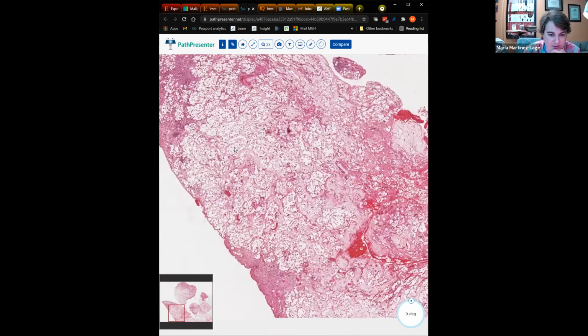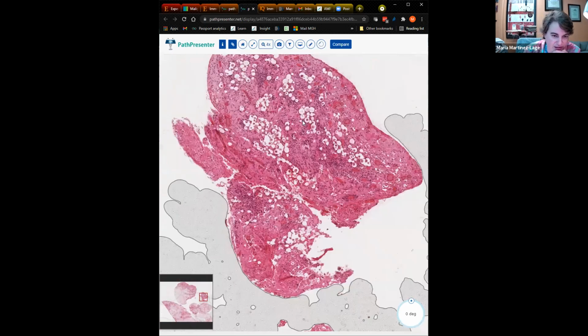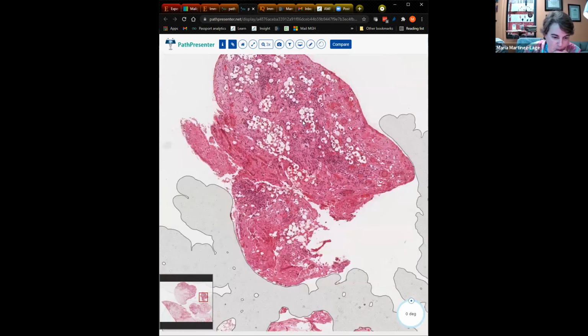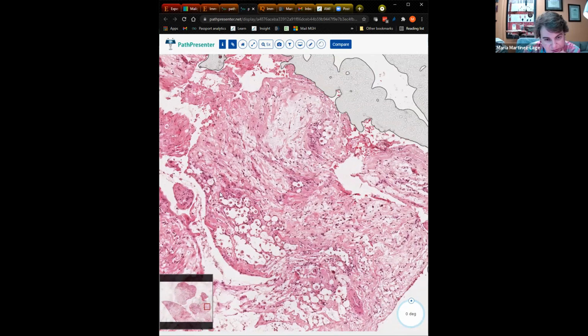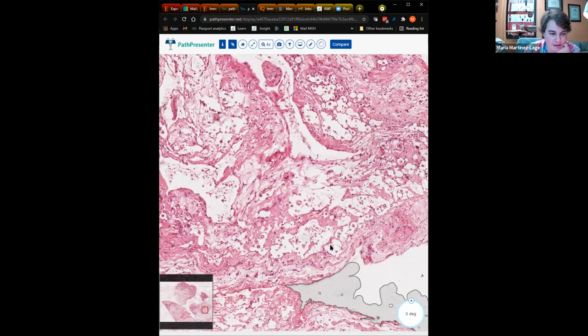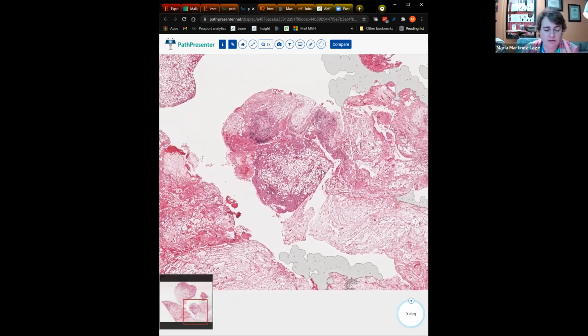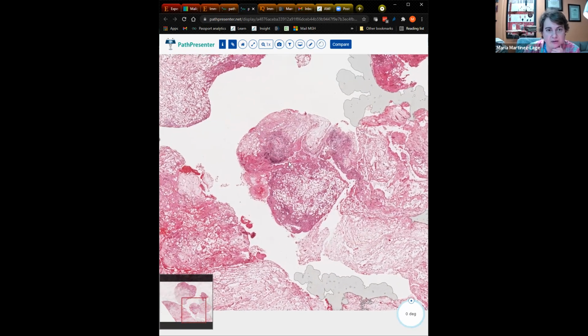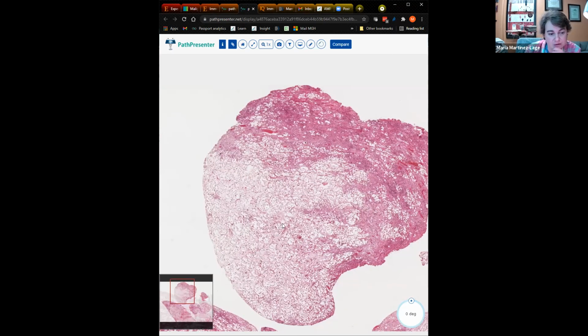Anything that occupies the leptomeninges is considered a meningitis. This looks more like a surgical specimen because it doesn't really have very good orientation, so it's hard to tell what's where in here. This is collagen, these are collagen fibers, so we are probably in the leptomeninges here rather than in the parenchyma. This would be expanding the leptomeningeal space. Remember that anything that occupies the leptomeninges can include organisms, can include cells in terms of inflammation, like autoimmune disorders, for example. It can include neoplastic cells, whether it's leukemia, lymphoma, or carcinomatosis, or even melanomatosis, or even gliomatosis. All of those things can occupy the leptomeningeal space widely.